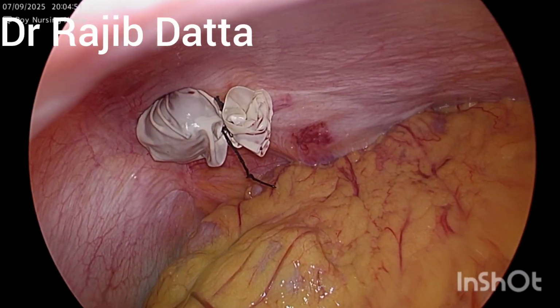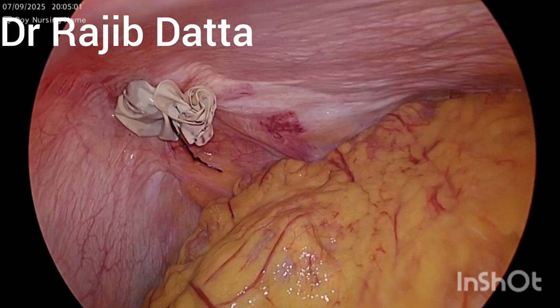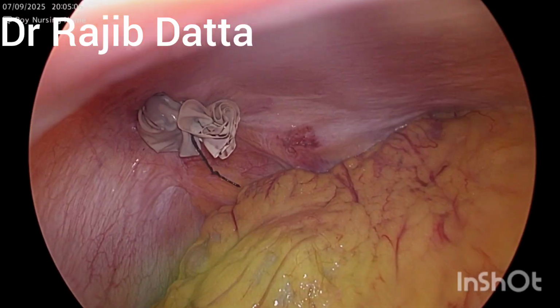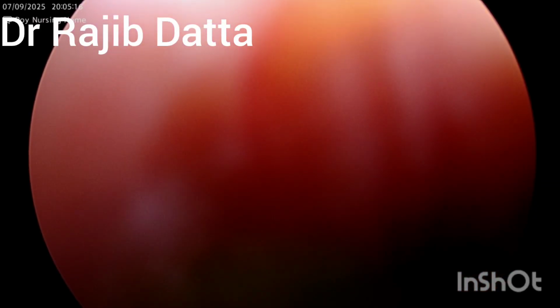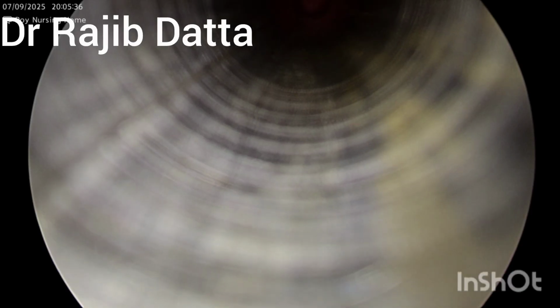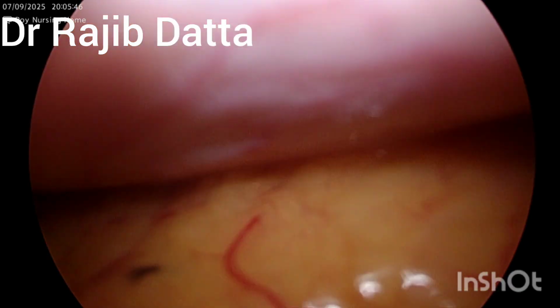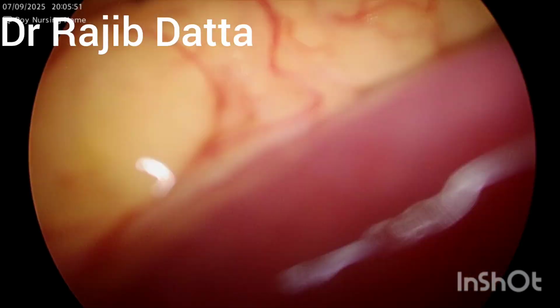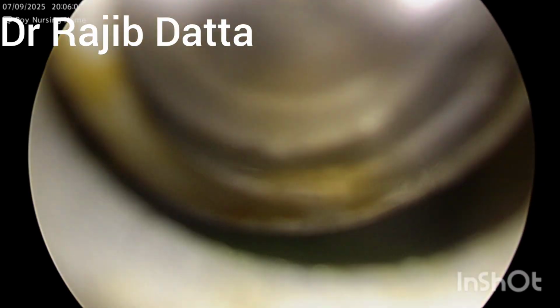So now a small part of the gallbladder is going to be retrieved out. So almost it is done. And just now our job is done. The gallbladder has been retrieved out through the umbilical port. Now our next job is to see the uterus, ovaries, and right iliac fossa also.